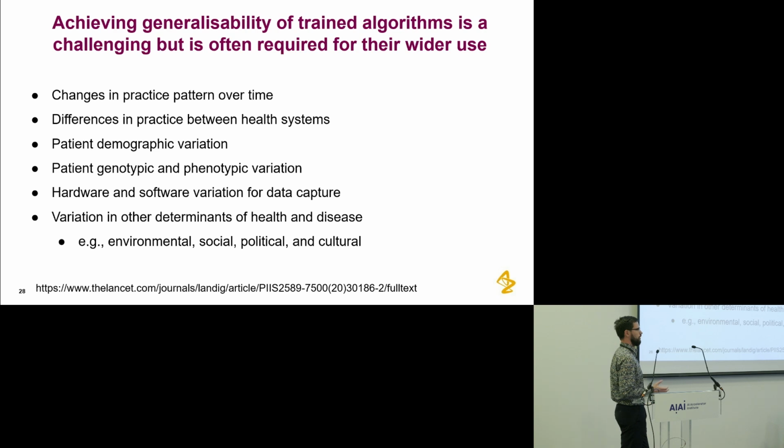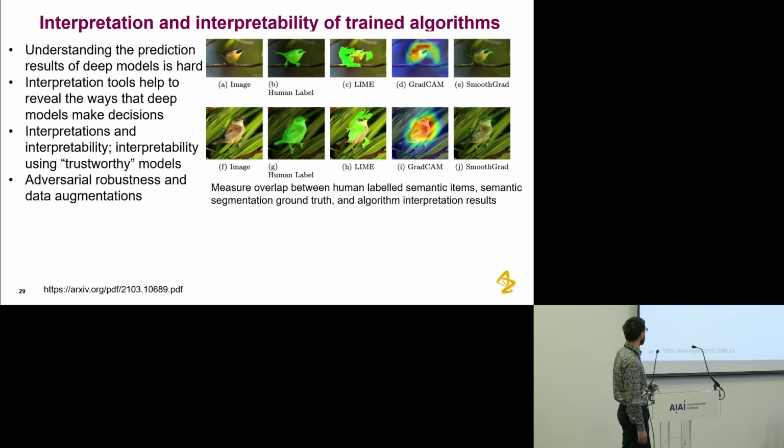Especially when we work on clinical trial data, we have a very limited data set. And when you go to real-world evidence data, then the data is messy. So there's no easy way to solve this problem. But we're definitely getting more and more data, and our models become better and better at generalizing.